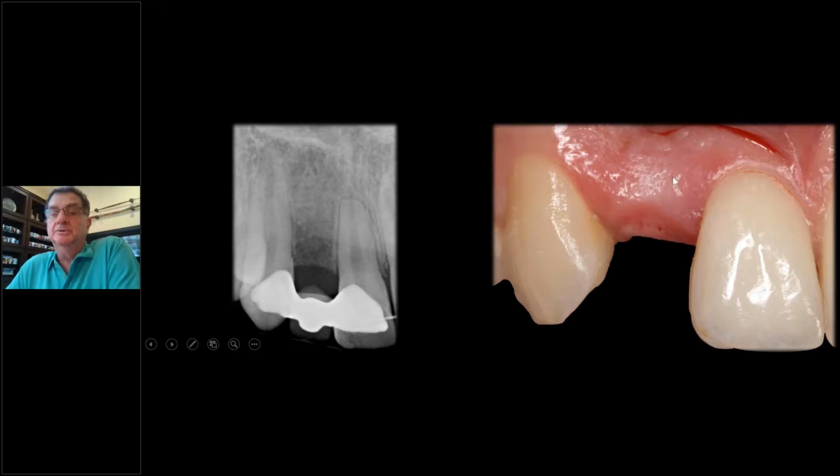I do a papilla sparing incision, and he's got a bit of a depression here too. So I'm going to have to build it up. See the darkness here? He's got a bit of a depression. Now, I don't want to open this up and cause recession here. I will tell you that 65% of the patients I treat today are redo of other people's work, just like Dr. Elaskary is showing. And that's exactly why we try to minimize our own problems, and the papilla is a major problem if it creates it.